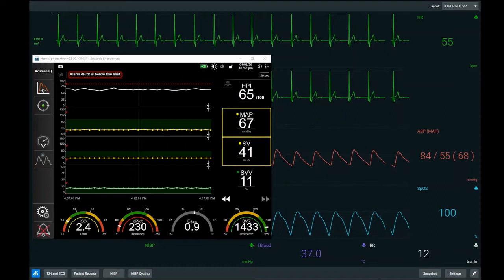To orient ourselves to the screens: in the background we have our basic patient monitor showing heart rate, invasive arterial blood pressure from a radial arterial line, and oxygen saturations. In the foreground we have our advanced hemodynamic monitor, the HaemoSphere, currently trending HPI at the top, mean arterial pressure, stroke volume, and stroke volume variation. The dials at the bottom show cardiac output on the far left, then DPDT — a measure of contractility we'll discuss later — EA-dyne, covered in previous modules, and systemic vascular resistance.